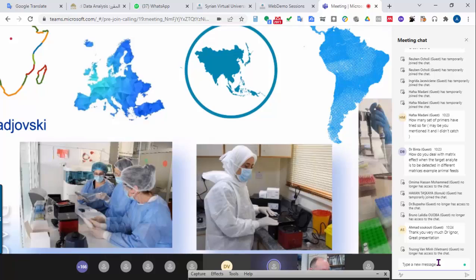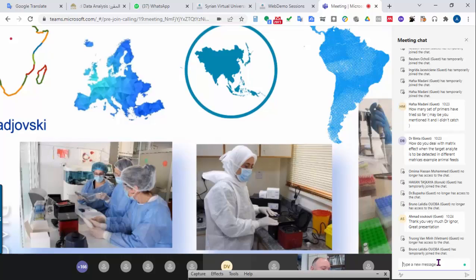Yes, as I said, it would be perfect to perform 20 replicates, because with 20 replicates you could have, let's say, one of these samples providing a negative result. So if you have 19 out of 20 detected as positive, giving a positive signal, this would be 95% confidence that this is the endpoint or the cutoff, the limit of detection.